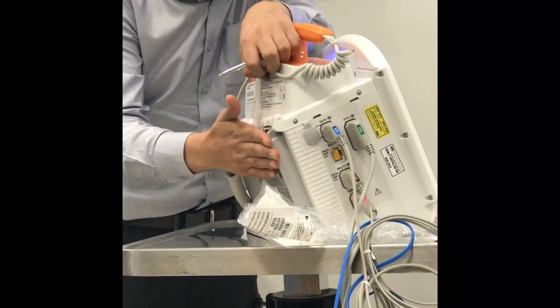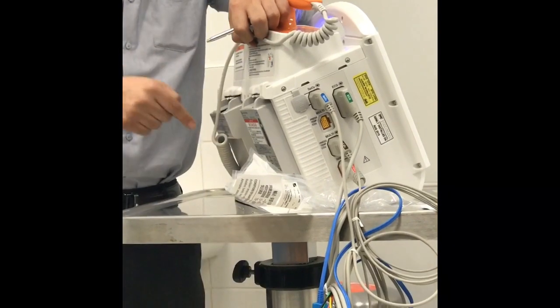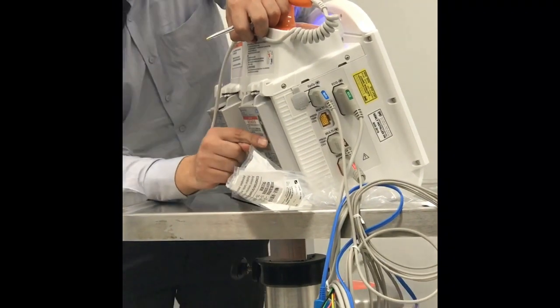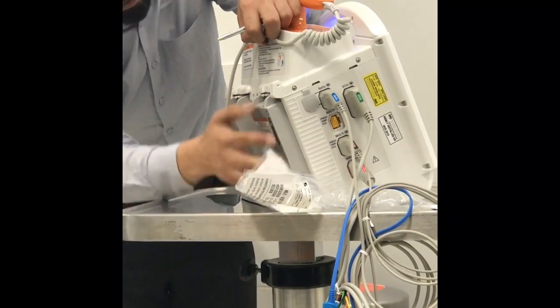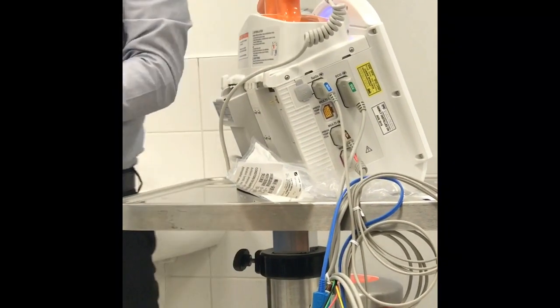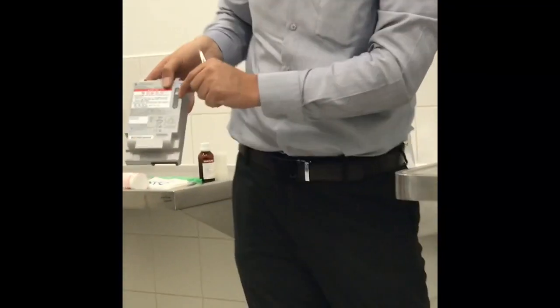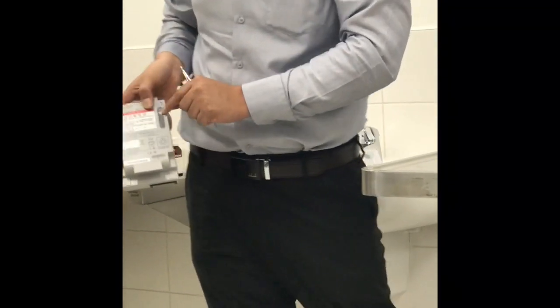Even if I need to know whether the battery is fully charged, from the back side I have to press here. You still see that you have the red. It is not full. And even if I take this one out and I have an extra battery, I need to know if it is fully charged. I can press here, and if all the LEDs are on, it has been fully charged. Okay, any questions for the battery and AC-DC module? Clear?